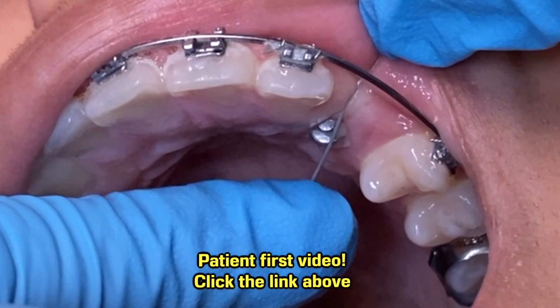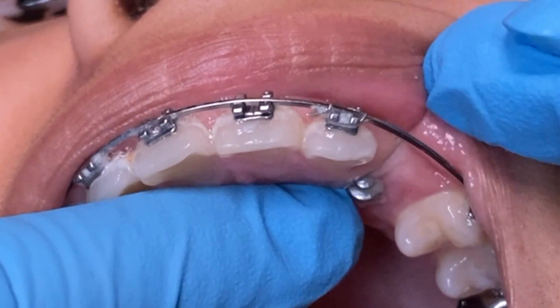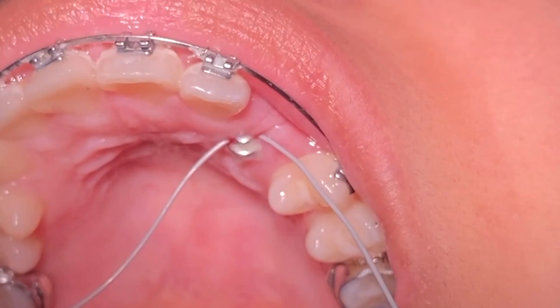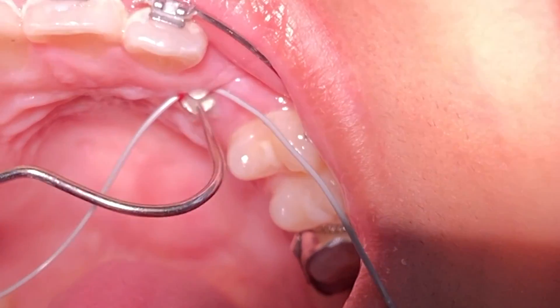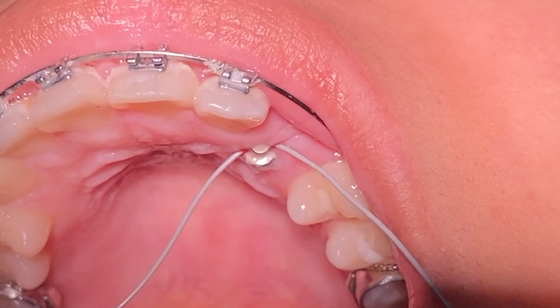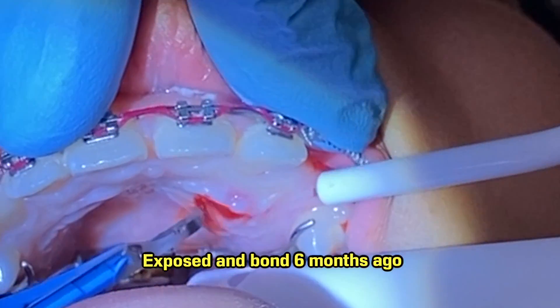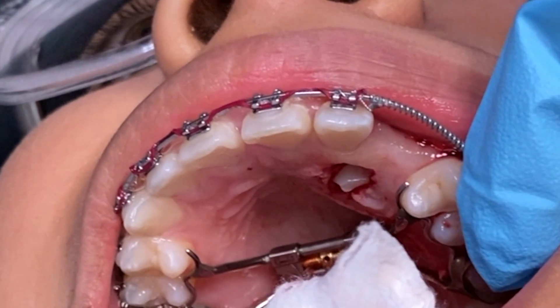As you can see, this patient has an exposed and bond. An exposed and bond is when an impacted tooth is impacted in the bone and we need to expose it to bring it out and align it with the other teeth. This patient had an upper impacted canine — we did an expose and bond and bonded a button to pull the tooth into place.